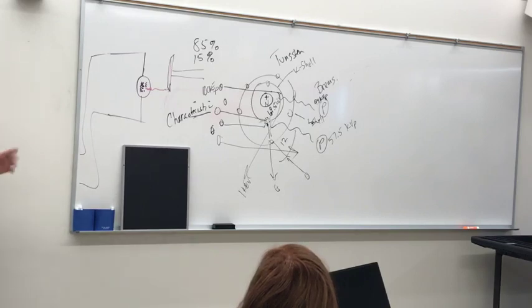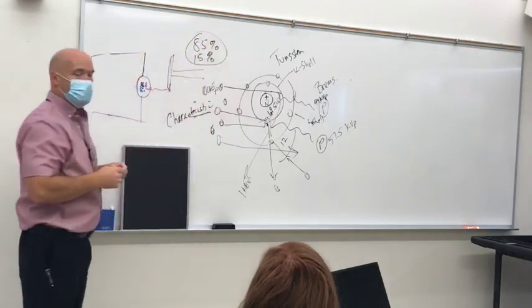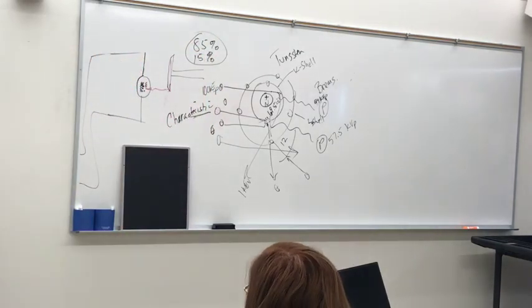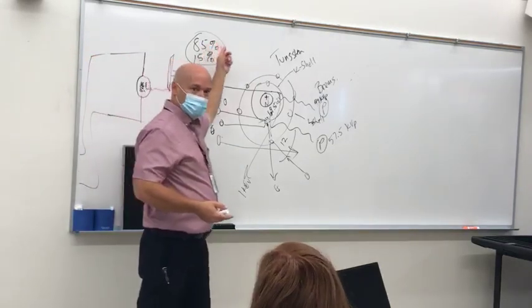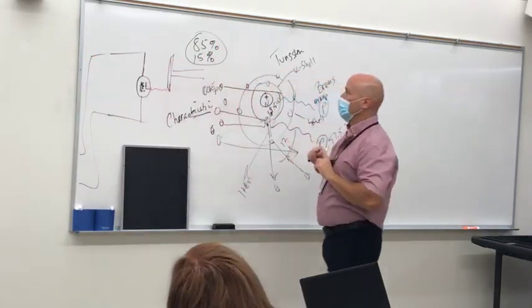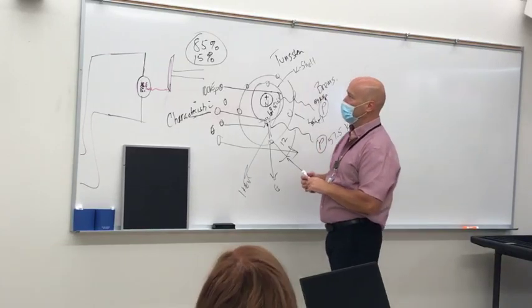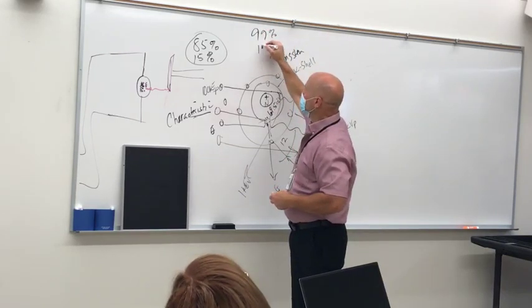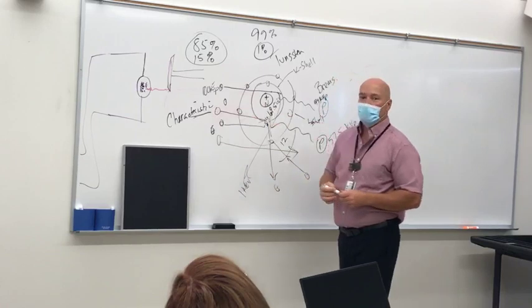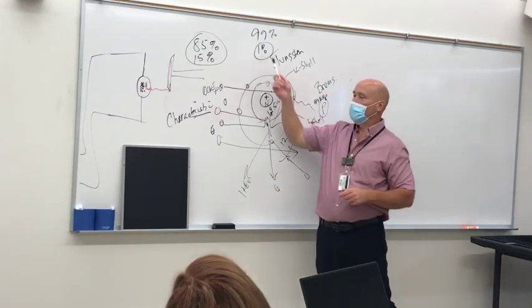But here's the rub. This is X-ray creation. The main thing that we create? Heat. Second to that is light. Third to that is split between these two things. And it's on the order of, an average X-ray beam, 99% everything else, 1% X-rays. So all that we've done yields us that.